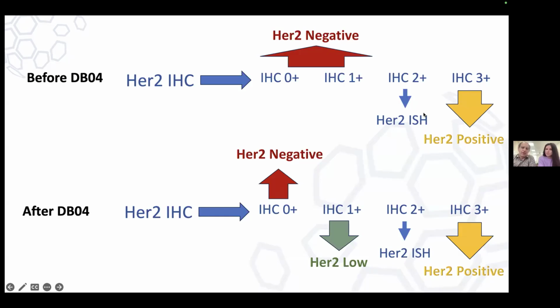This system, despite scaremongering from some of our colleagues, worked very well, and the concordance amongst pathologists is really, really high. The amount of errors made is a few percentages, and we are well into the 90s, 95+% concordance. It's a very robust system. Yeah, we need to mention that we're talking about breast here. So only breast, gastric is another matter. Fantastic. Yeah, of course.